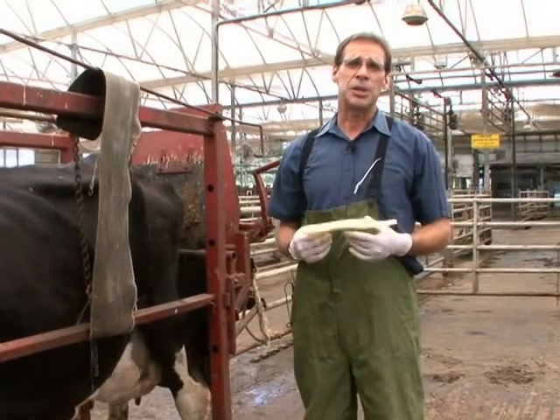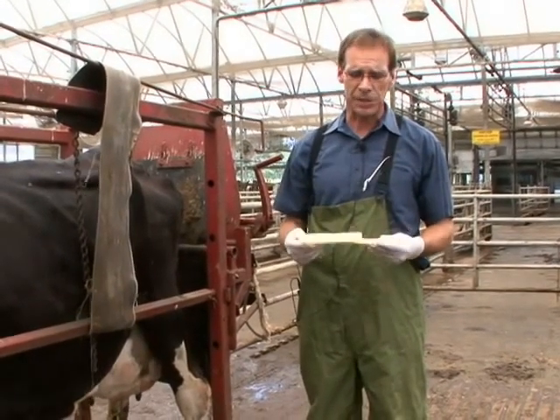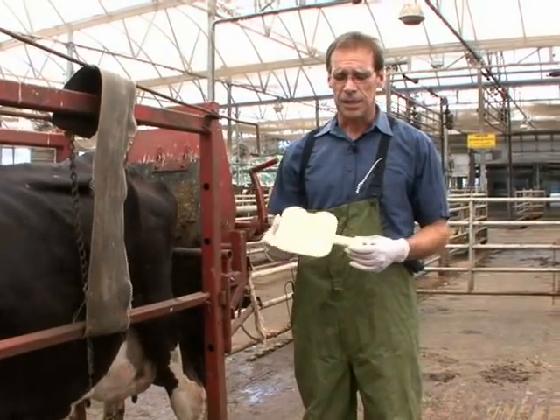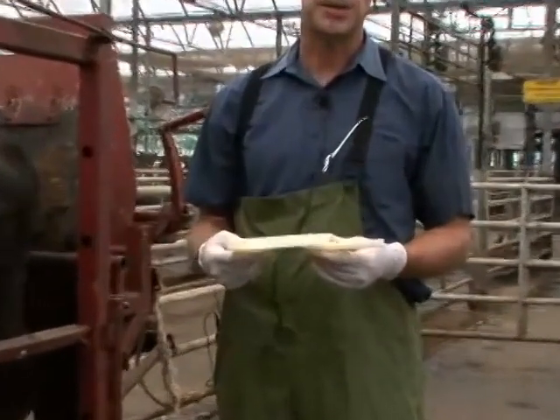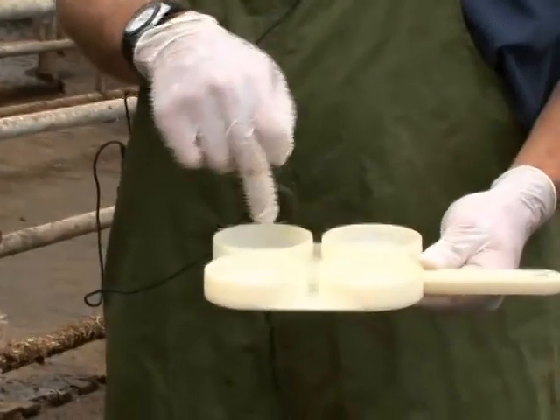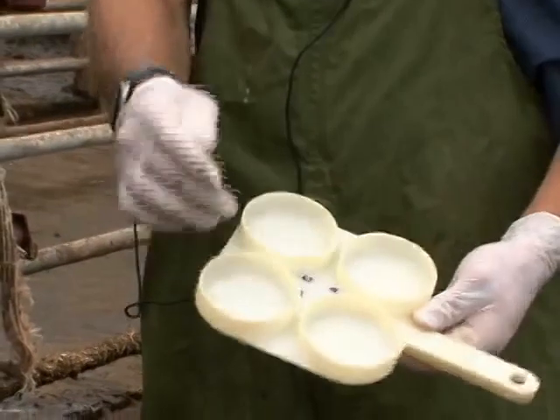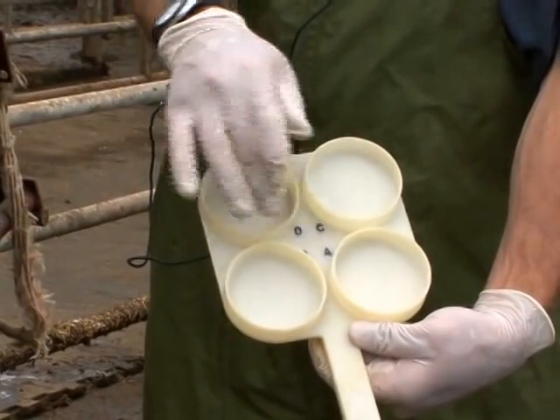So in order to determine if cattle have subclinical mastitis, we use a cow side test known as the California mastitis test. This is the paddle that we use to determine whether or not these animals have a high somatic cell count in their milk. Each one of these separate wells signifies a different quarter on the cow. You can see each one of these wells are labeled by a different letter.